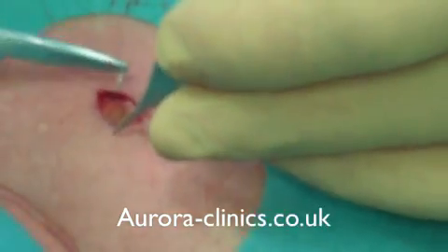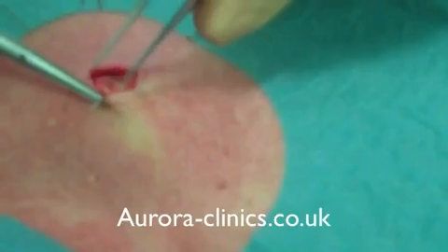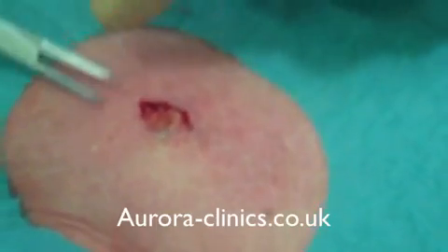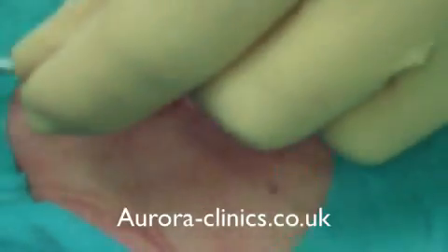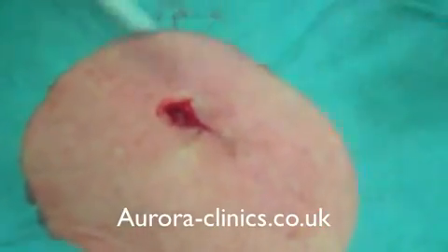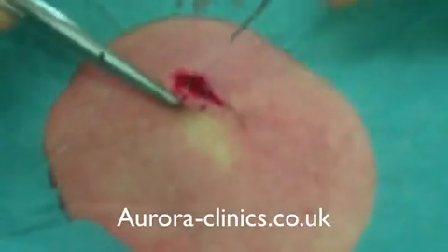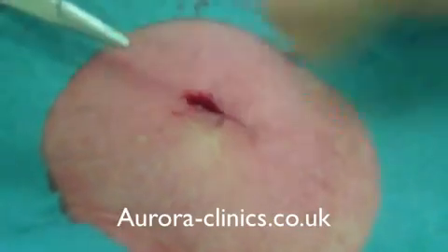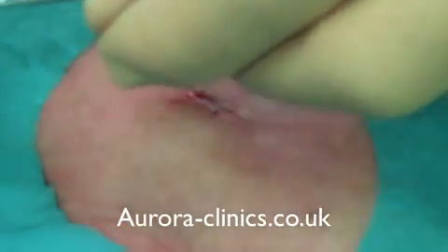Closure is just like many other closures we've done, with subcuticular stitches. Often, because it's been inflamed, the area is a bit scarred, so when you take the skin away, it does open up significantly. So I use deep buried stitches of 5-0 Monocryl in this area. I'll probably put two of them in, one there, one now, and that's enough, if done correctly, to take all the tension off the incision and have no tension on the skin. As I've mentioned before, it's the tension on the skin that causes pore scarring, so these stitches really do help avoid that.